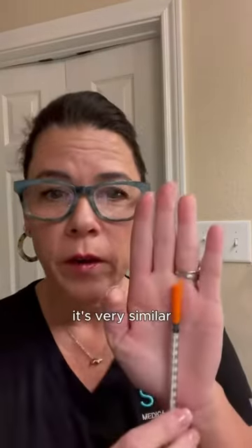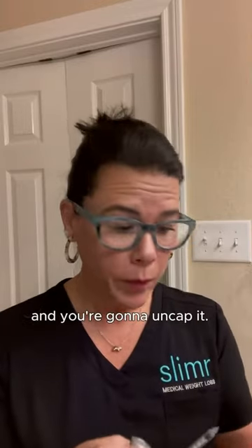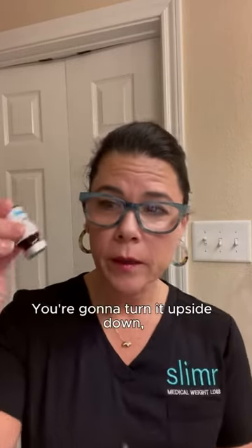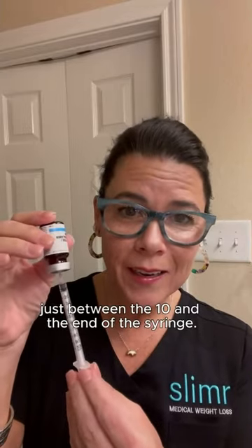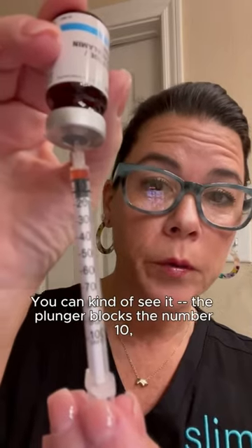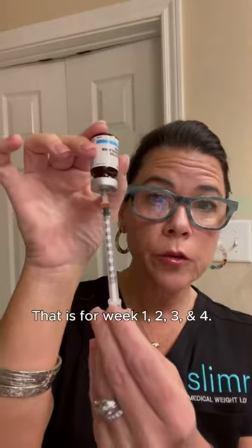I'm going to get this syringe here — it's very similar, if not exactly like the one that you get. You're going to take your syringe and uncap it. Your first low-dose semaglutide is going to be five units, 0.25 milligrams. You're going to turn it upside down, put the needle in the middle in that little silicone part, and pull back the syringe just between the 10 and the end of the syringe. It's not much at all. The plunger blocks the number 10, which makes it difficult to see. Five units — that is weeks one, two, three, and four.